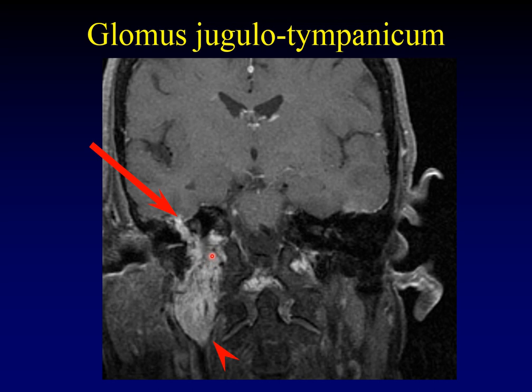There's a tail of enhancing tumor extending out into the middle ear cavity — in this case filling the middle ear cavity and heading intracranially through there. This is a very large glomus jugulotympanicum tumor.